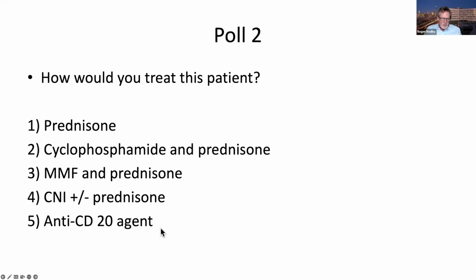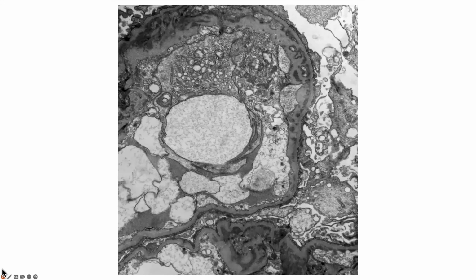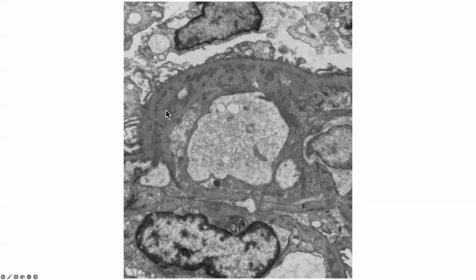Next. So before we go to that, Mel, what's your pathologic diagnosis? Roger, may I ask David a question before she tells us what she thinks? I certainly hope so. Were there any tubular reticular inclusions, David? No, none were seen. And were there any fibrils, David? Because cryo sometimes can have fibrillary structures. No, the deposits appeared granular, as you saw here in the picture. There was no substructure to them.